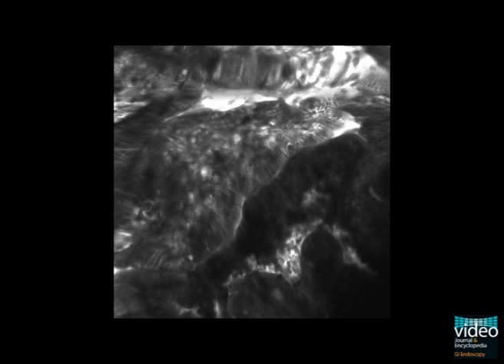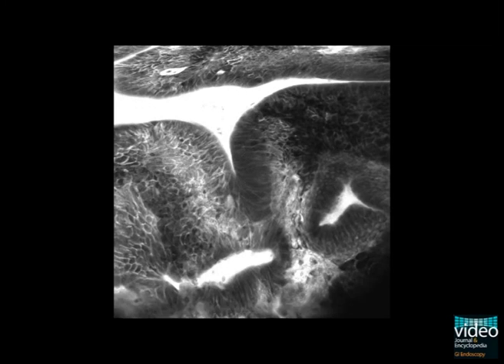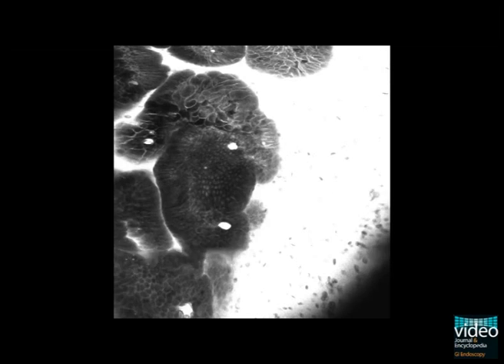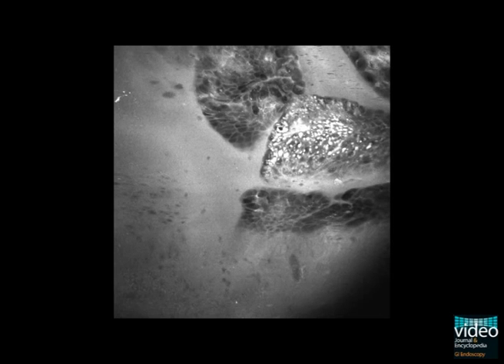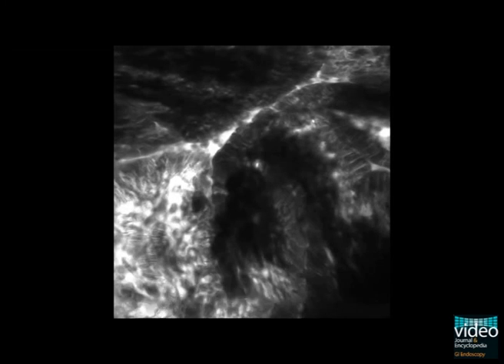The transition zone to neoplastic tissue is scanned. The mucosal microarchitecture is progressively lost. The epithelial height and size of the individual cells are irregular in superficial sections. Residual pit-like architecture is seen, but irregular cells are no longer confined by a basal membrane. Often very dark, irregular cells indicate neoplasia.